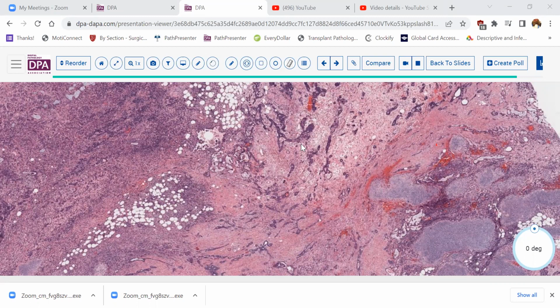And the only caveat that I would say with that is that in certain circumstances, such as with a prolapsed polyp or where you've had instrumentation of the endometrium, the presence of a chronic endometritis type of reaction pattern should be expected and may be frequently encountered in that setting. But in the otherwise, quote, normal appearing undisturbed endometrium, one plasma cell is sufficient to make that diagnosis.